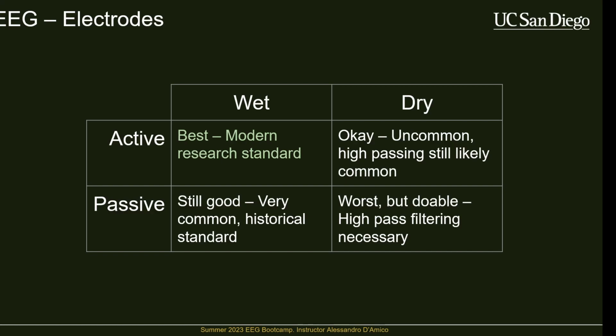But you can buy any of these, right? It's not difficult to go online and order a set of any of these. Even OpenBCI sells some active dry electrodes for their headset, although you're going through a third party company.